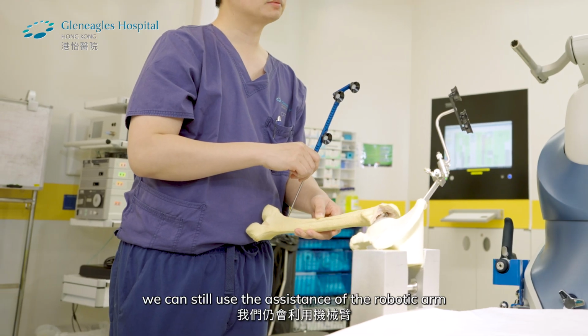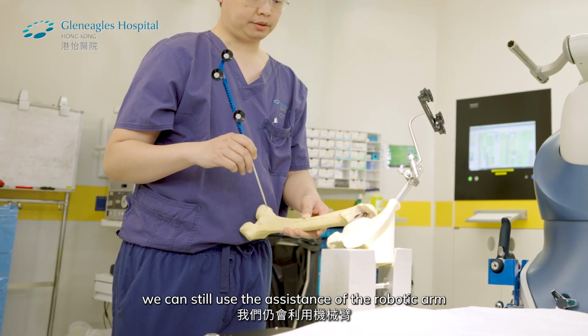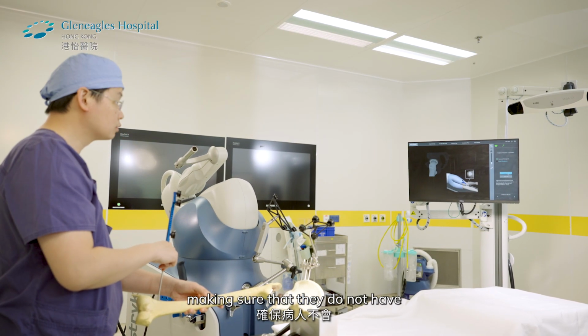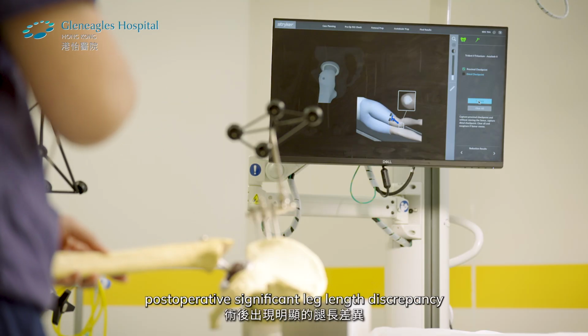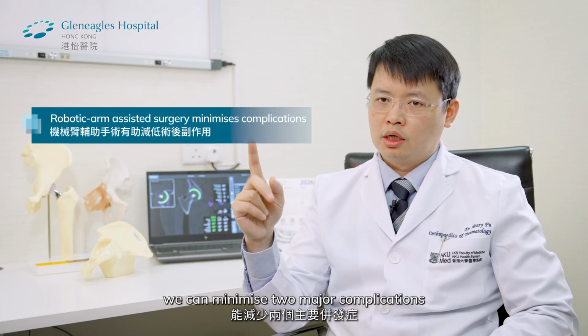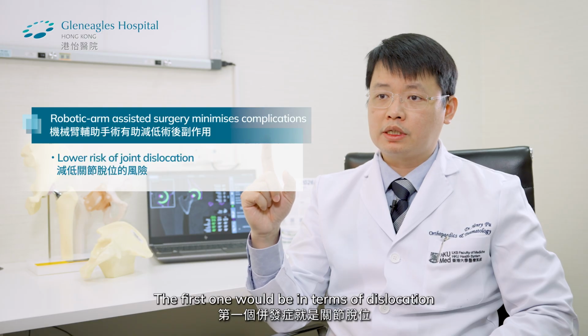We can still use the assistance of the robotic arm to allow us to assess the patient's leg length, making sure that they do not have postoperative significant leg length discrepancy. Basically, with the robotic surgery, we can minimize two major complications. The first one would be in terms of dislocation.